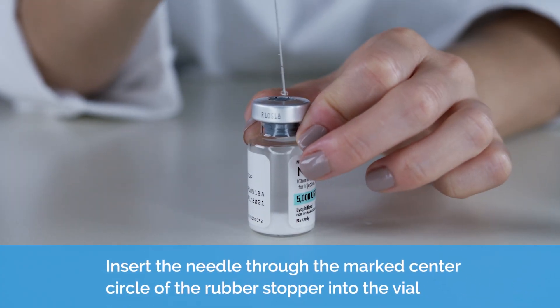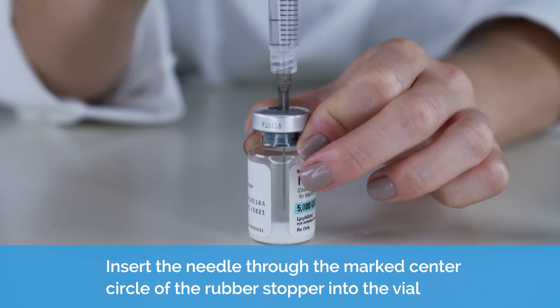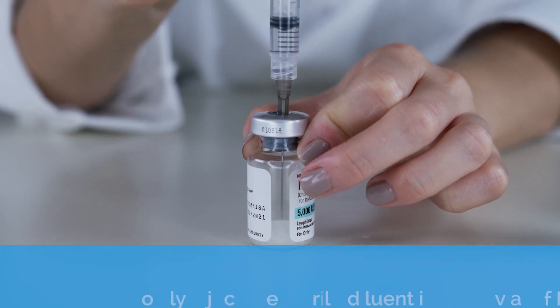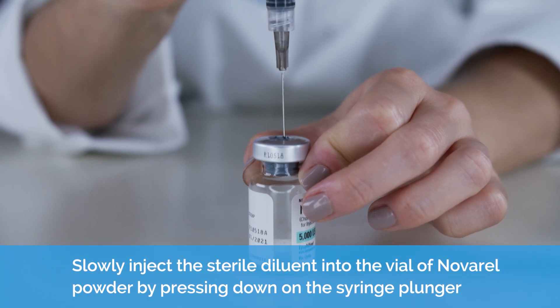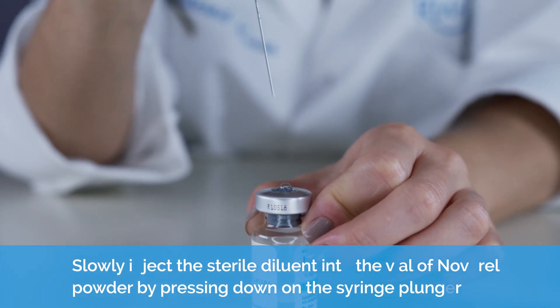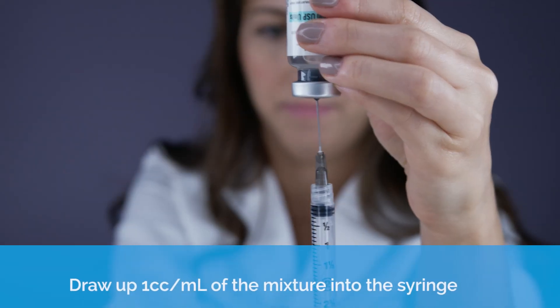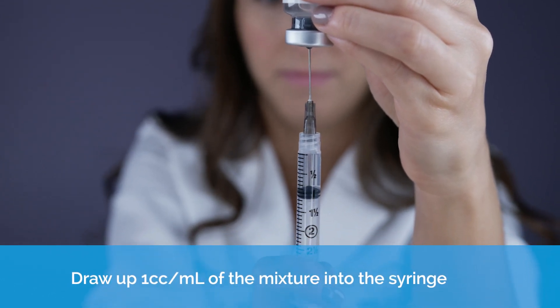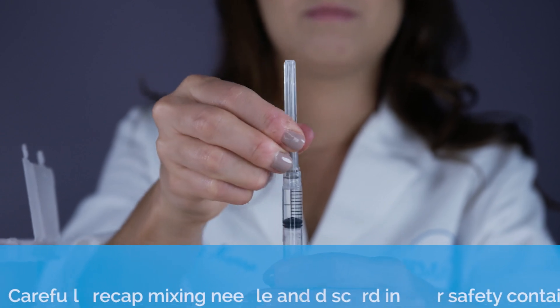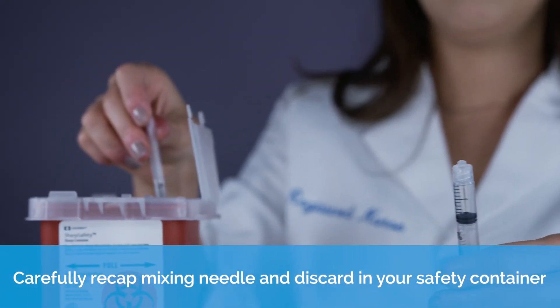Place the vial containing Novorel powder on a hard flat surface. Insert the needle through the marked center circle of the rubber stopper into the vial. Slowly inject the liquid into the vial of Novorel powder by pressing down on the syringe plunger. Draw one cc or milliliter of the mixture into the syringe. Carefully recap the mixing needle and discard in your safety container.